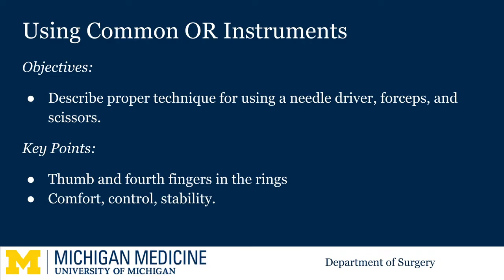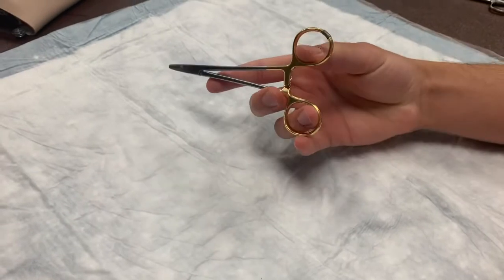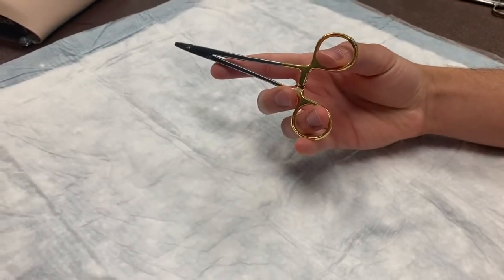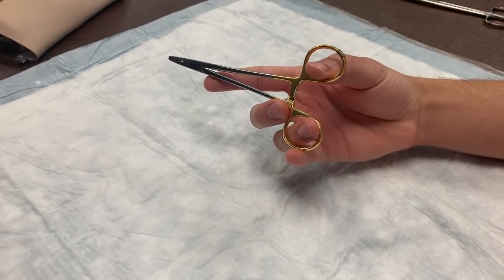Some key points are to have your thumb and fourth fingers in the rings and to hold it in such a way that you have comfort, control, and stability. You pick up the needle driver with your thumb and fourth fingers in the rings, your index finger extended for stability, and your third and fifth fingers curled around the bottom ring.